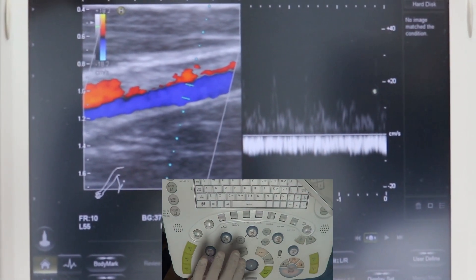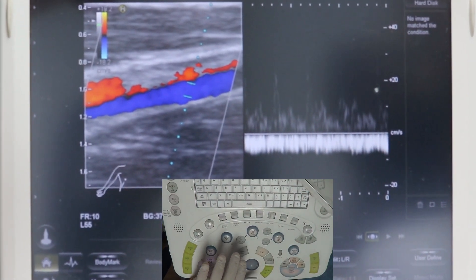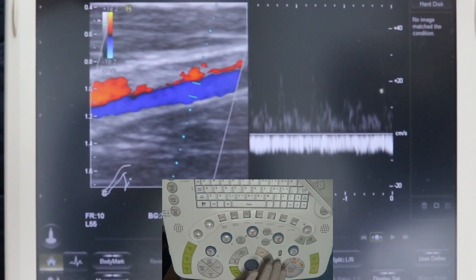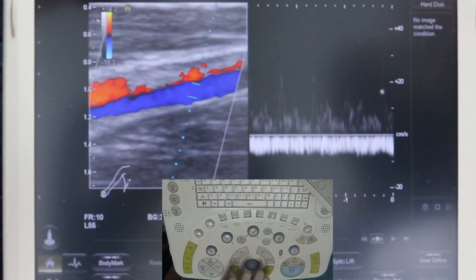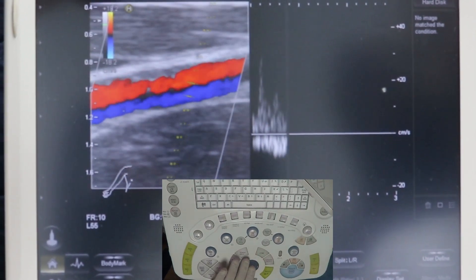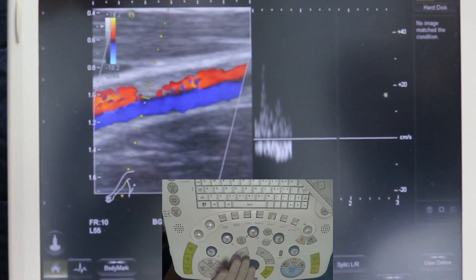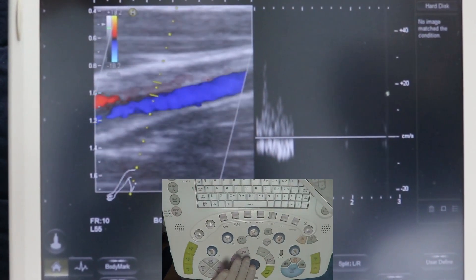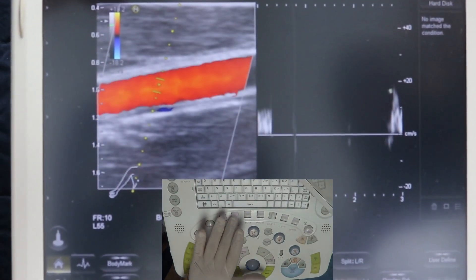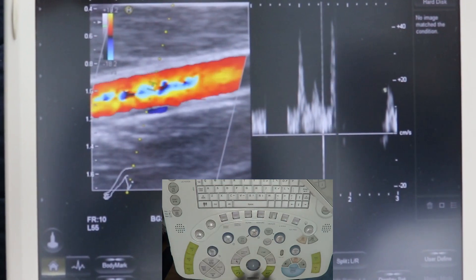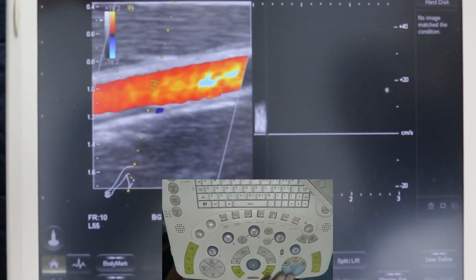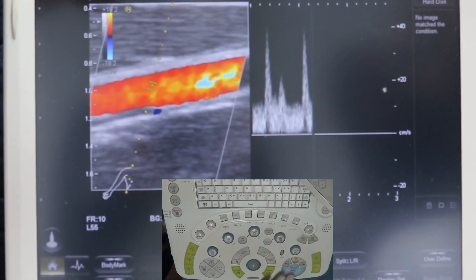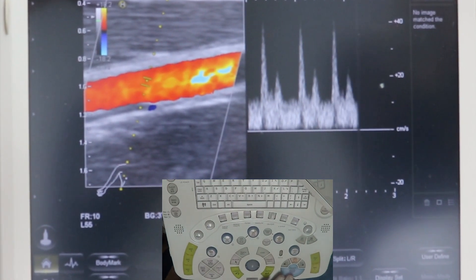This approach is good for the vein, and in the artery, you can make the sample volume small to get a good spectral flow pattern.